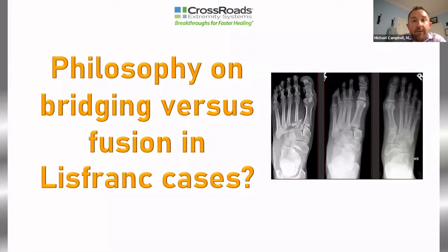I won't do transarticular screws. If I was going to fix it, I would bridge plate it. I can't think of anywhere else in the body where I would think it acceptable to fire a screw across a joint and then come back and take it out. So I don't do that in the midfoot. But the bridge plating is, I think, a reasonable option. It's 2 surgeries, and again, I'm a big fan of one and done.